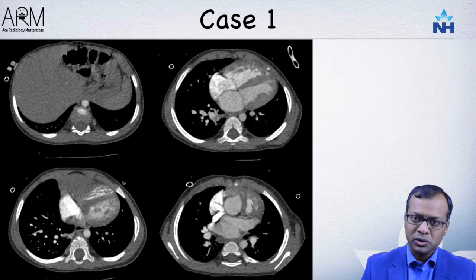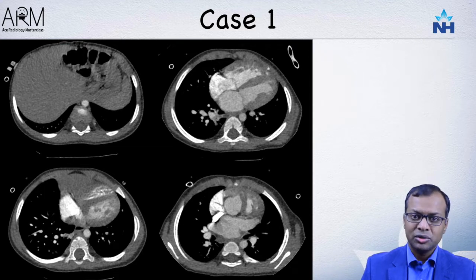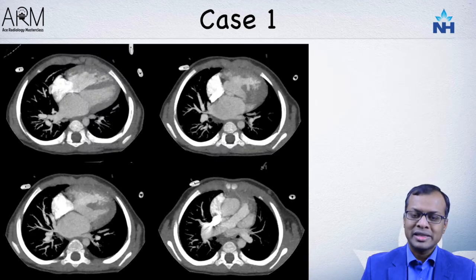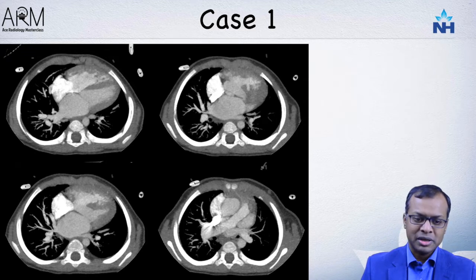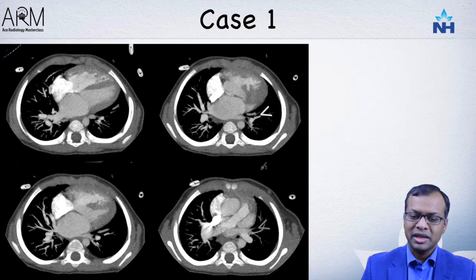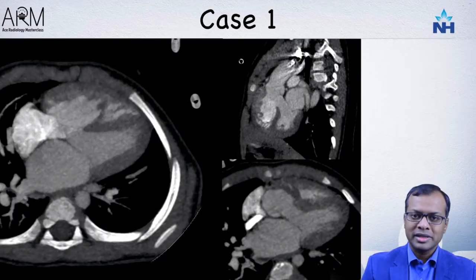As part of the situs assessment, it is also useful to look at the lung anatomy, making sure the right trilobed lung is on the right side and the left bilobed lung is on the left side. The next step is to look at the pulmonary venous return. It is important to track each individual pulmonary vein to confirm it is draining into the left atrium. Here you can see the right inferior, right superior, left inferior, and left superior pulmonary veins all draining into the left atrium.